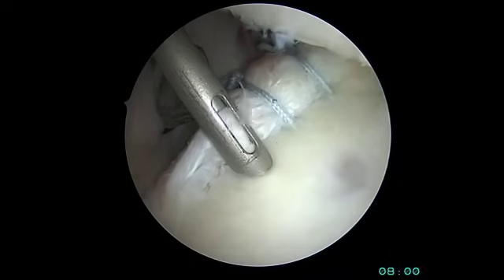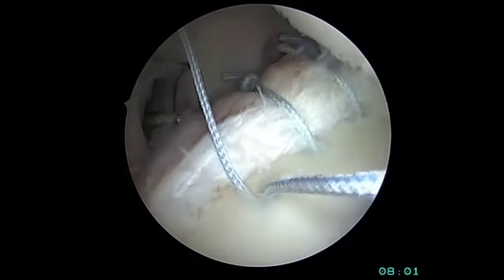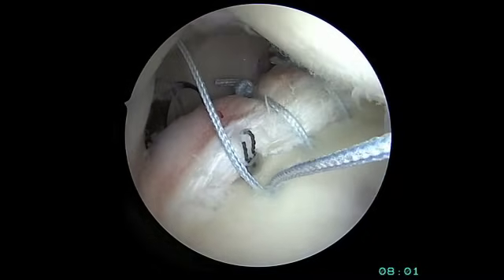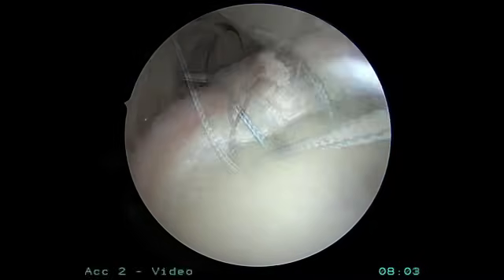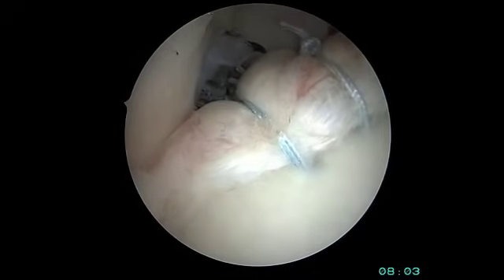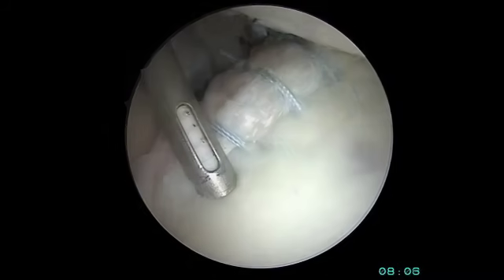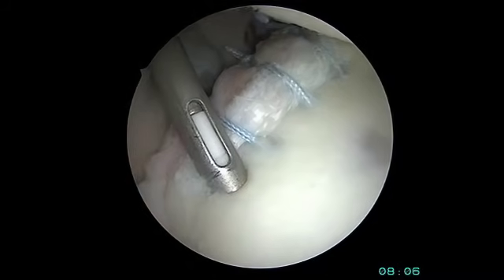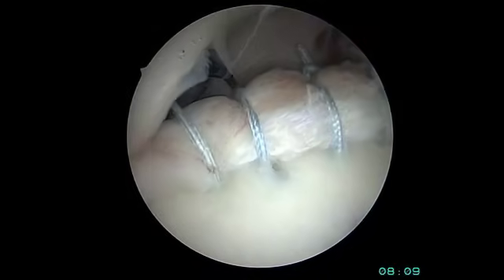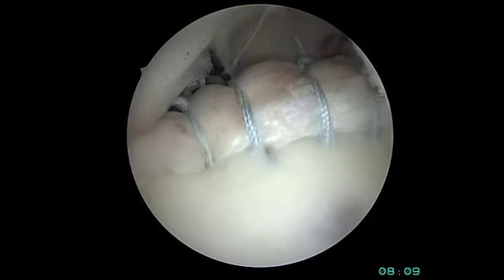A third suture anchor is required. After drilling the hole, the anchor is placed in, suture passing is performed in the same fashion, and the knot is tied in the same fashion. One more anchor is then required for this particular posterior labral tear, with suture passed and the knot tied in the same fashion.